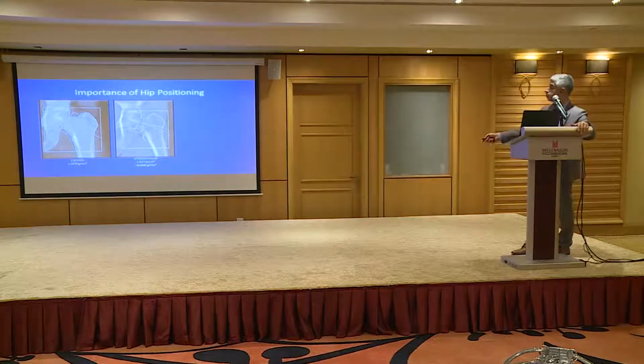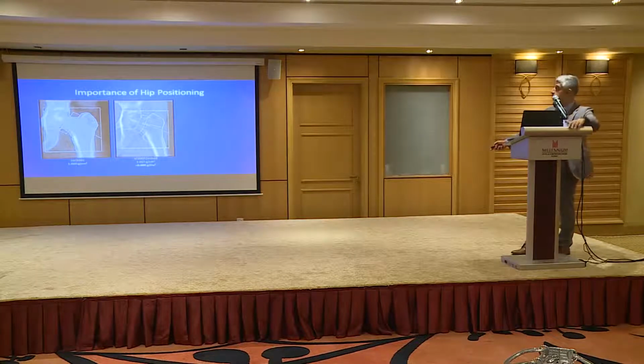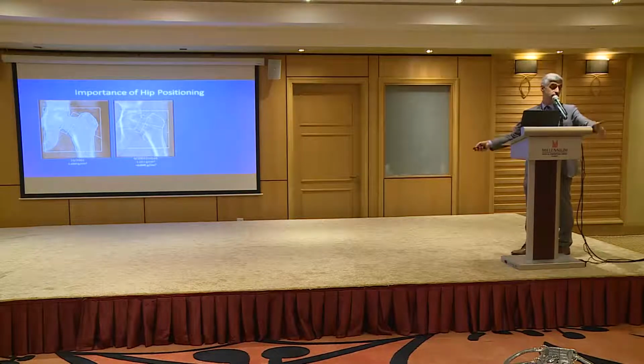This is also important about the hip positioning. So this has had a baseline DEXA scan. Good positioning. It looks like an abduction, internal rotation very well. The box is good. It's anchored to the greater trochanter because this is a hologic scan. So everything looks good. This is his BMD value. Then after 2 years, he had another scan, and it showed that he had only about 0.8% gain, which, with any least significant change, is nothing, basically, right?